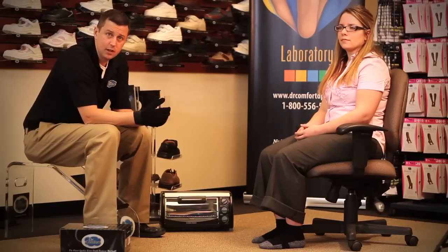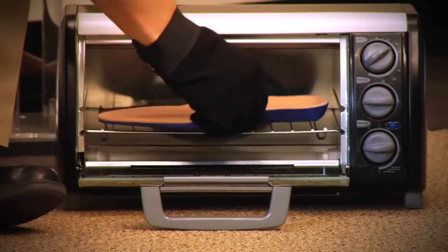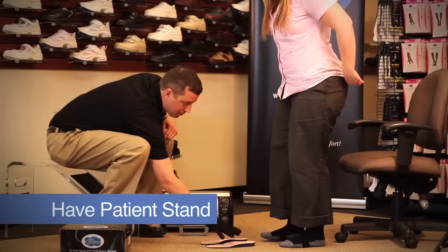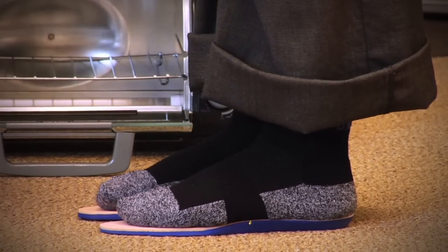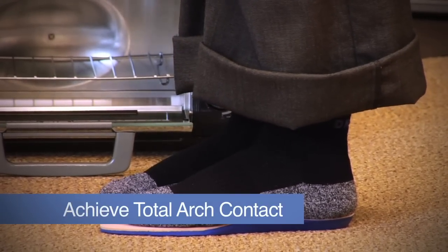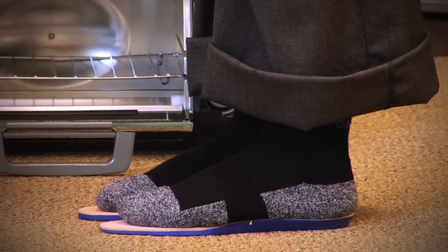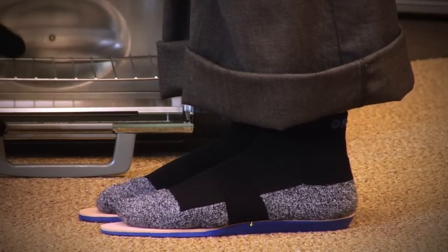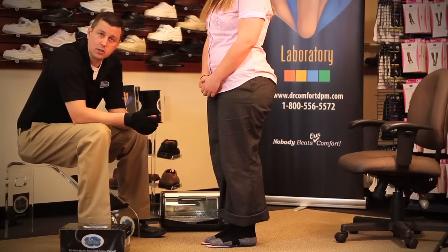When the timer goes off, it's time to remove the inserts and have the patient stand on them to start the heat molding process. Have the patient stand up weight-bearing and put both feet on the inserts. The idea is to ensure the arch is achieving total arch contact — if it does not, add a scaphoid or arch pad. Additionally, while those are heat molding on the patient's foot, take out the next pair and place them in the oven. This is how to heat mold an insert using the convection oven.